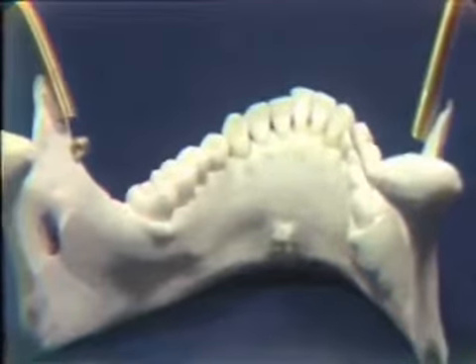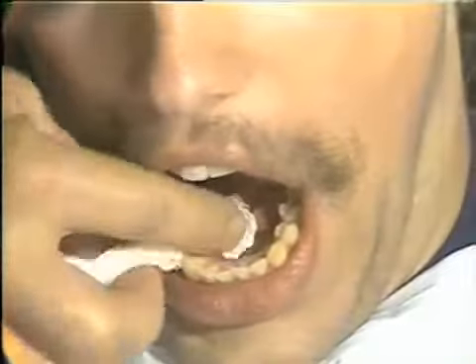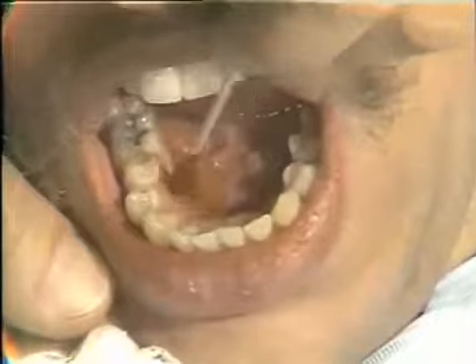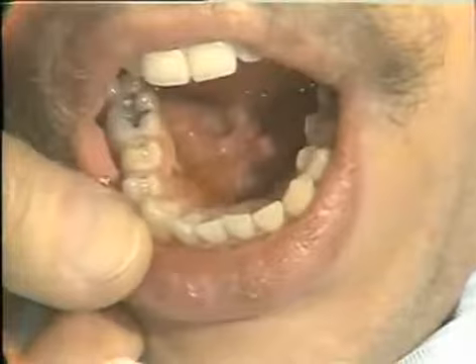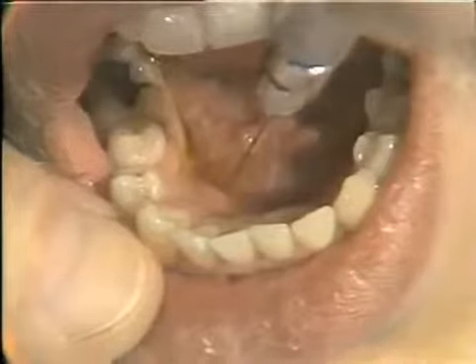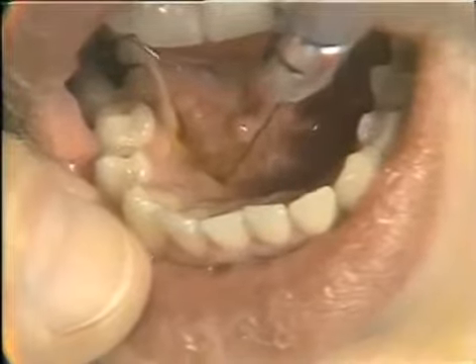Let's try it on the patient. All right, let's show it on the patient. Andy, if you'll open real wide for me, please. We'll dry our mucosa again in the usual fashion, and then we'll apply a little betadine to our injection site right in the floor of the mouth where those tissues reflect onto the alveolar ridge, just lingual to the cuspid. And then we come in with our syringe at about this angle, make our penetration, and just carry our needle bevel a few millimeters, 2 or 3 millimeters below the surface of the mucosa.